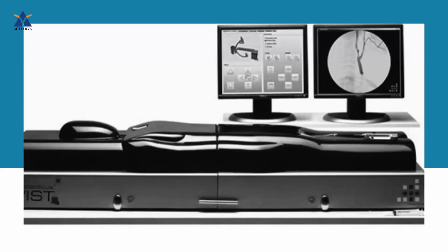So you'll have external input devices. Here you can see the model of the patient. You can connect external input devices to this so that you can use catheters, stents, guide wires, and contrast to simulate the actual interventional procedure.